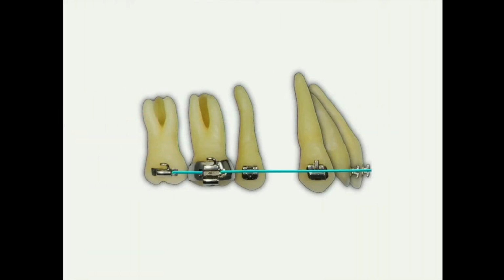Look at this picture. An undersized arch wire goes along the dental arch, and we also put in the miniscrew between tooth number 5 and number 6, and also create the line of action of the force to retract the anterior teeth like this, and see what is going to happen.